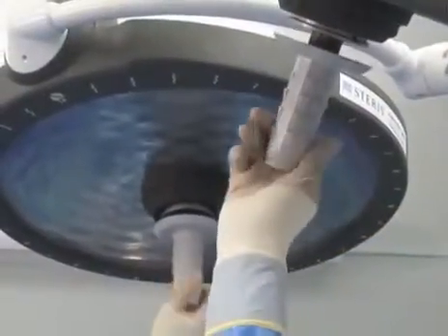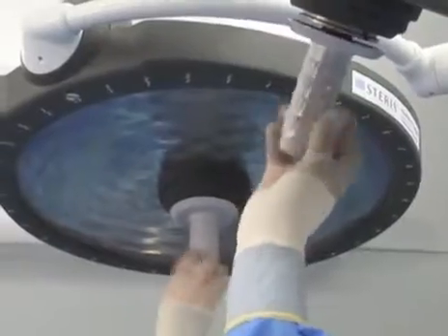The sterile light handles are given to the surgeon, who attaches them to the operating room lights.